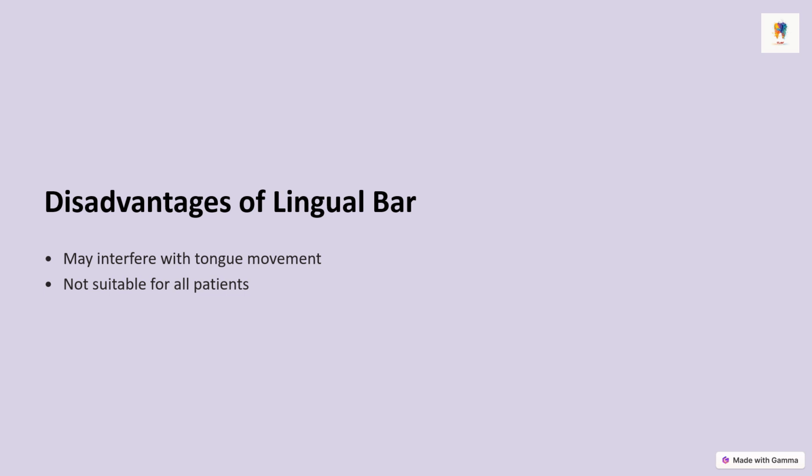Similarly, it has some disadvantages as well. It may interfere with tongue movement. Every kind of connector can interfere with your tongue movement if not made correctly.